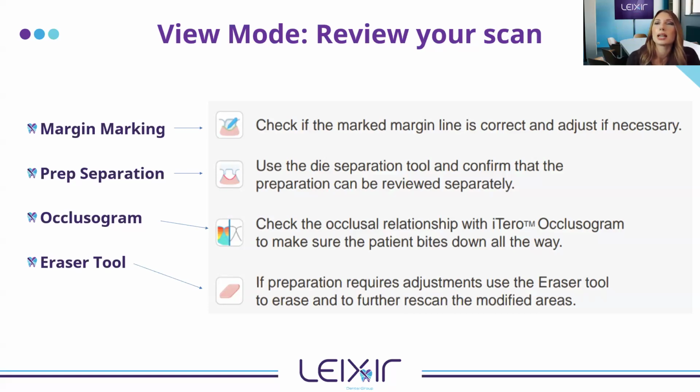But when you select that margin marking tool, it's going to auto-populate your margin for you. It is not 100% accurate. So you do need to evaluate that and adjust it if you are truly marking your own margins. If you accidentally select this tool and it auto-populates and you just back out of it, it still saves that and sends that to the lab.